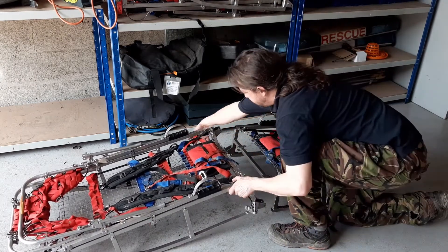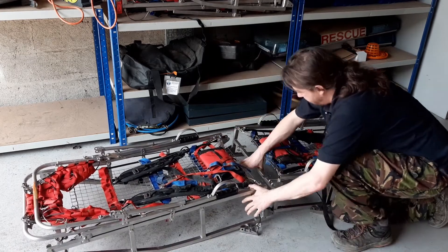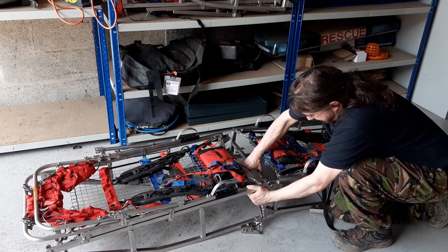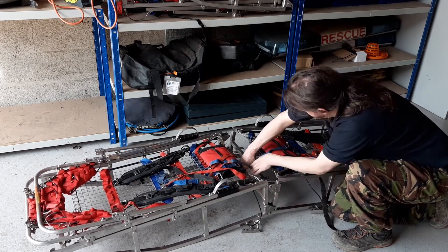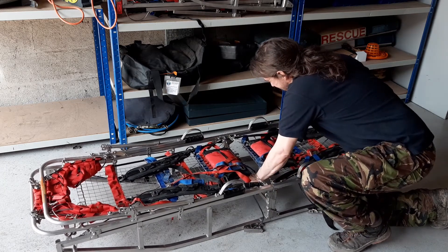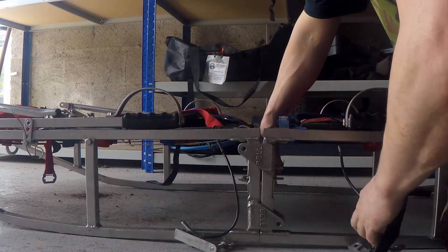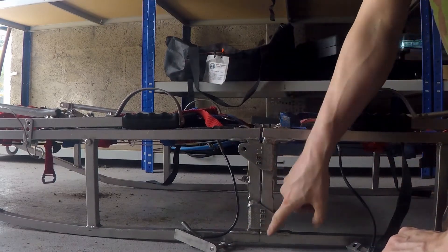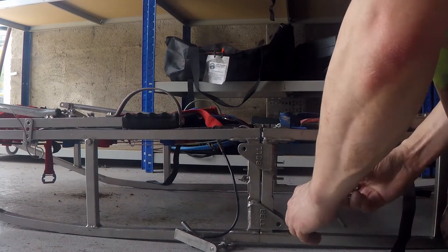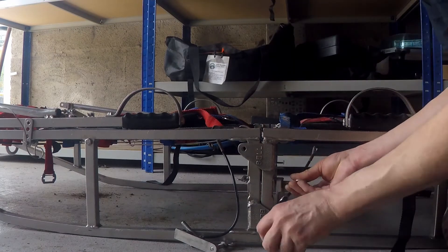One advantage of doing it solo is that if any of your fingers get caught, it's your own fault. So if we bring the stretcher together starting off horizontal - we can do that - but the problem is it has a habit of wanting to sag apart, so it's not aligned properly. Not a huge problem though.